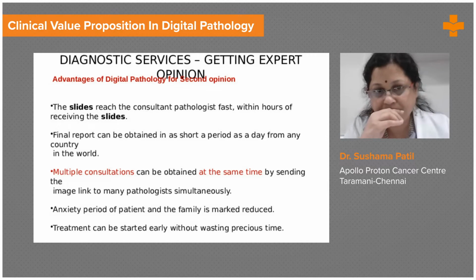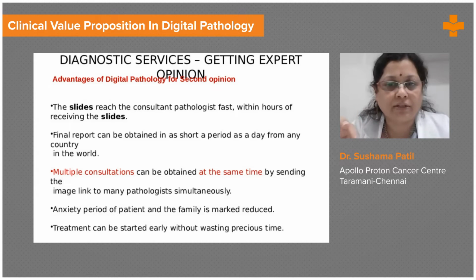So one, the slides reach the consultant pathologist fast, within minutes to hours. Okay, and the final report can be obtained within a very short period of time, as soon as a day, from any country in the world, anywhere it can be reached. Multiple consultations can be obtained at the same time by sending the image link to many pathologists simultaneously. So if there is a discordance between two pathologists, it can be shared with a third pathologist to come to a conclusion. So this is a very useful feature. You couldn't have done this if digital pathology files were not created through digital imaging.